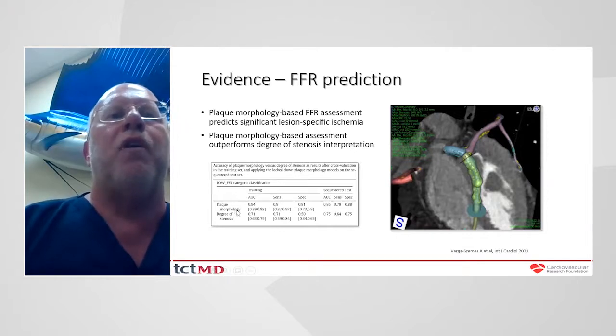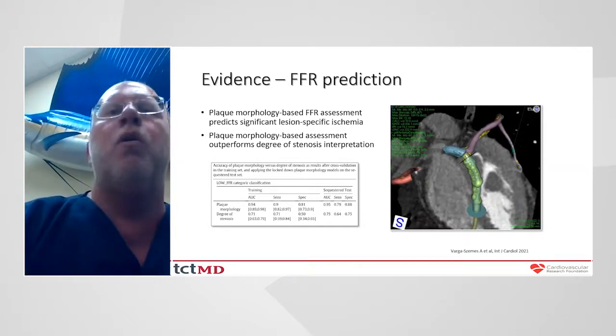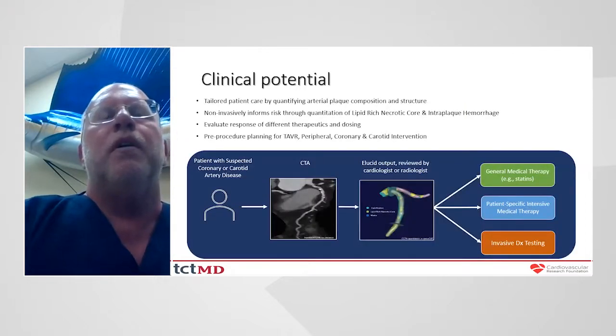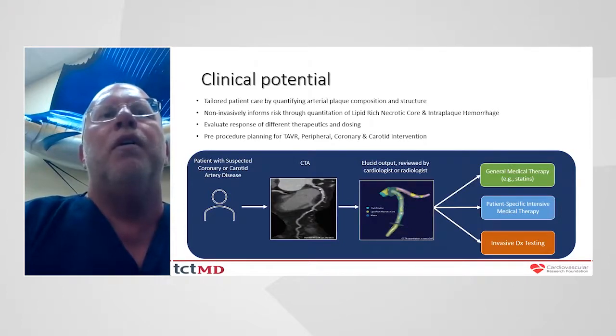Like with all FFRCT software that we've seen, we become a lot more specific in calling a plaque stenotic. So you're saving a lot more patients from going to the cath lab unnecessarily, and you can manage your patients according to their FFR analysis, whether they should undergo revascularization or not. I think from what I said, the clinical potential is evident and is very congruent with everything else that has been said on this webinar.